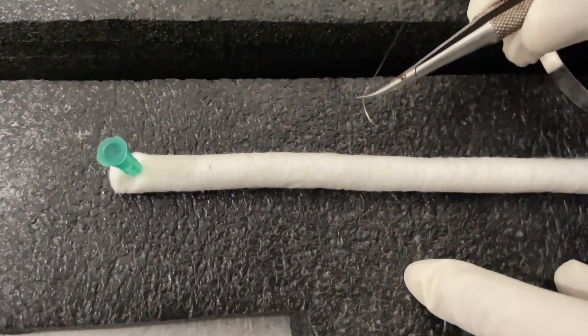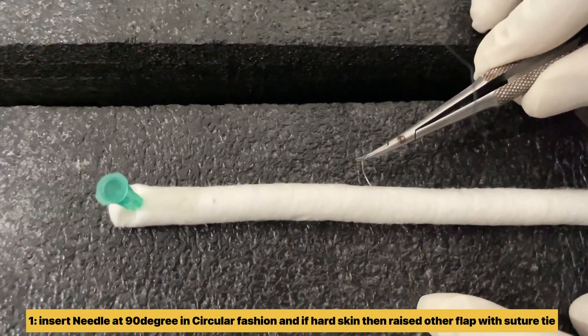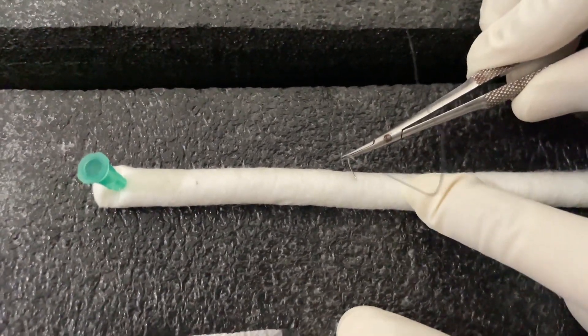Insert the needle in a circular fashion at 90 degrees, and hold the other flap of skin with the suture tie if the skin is hard.